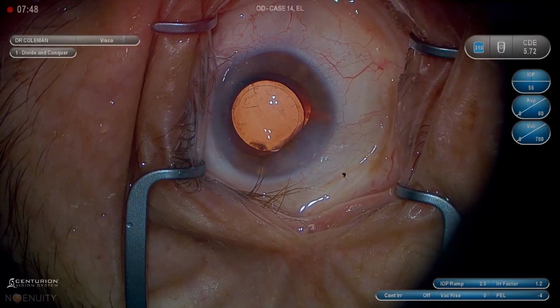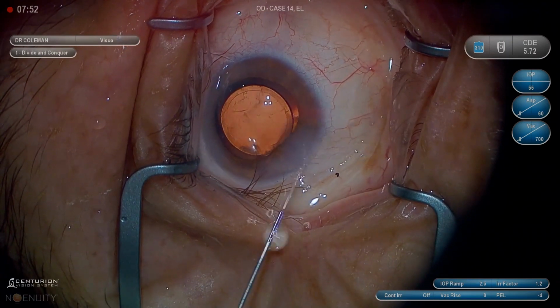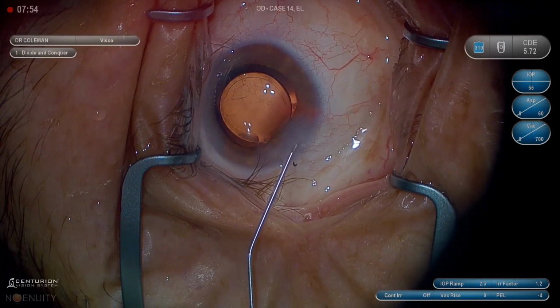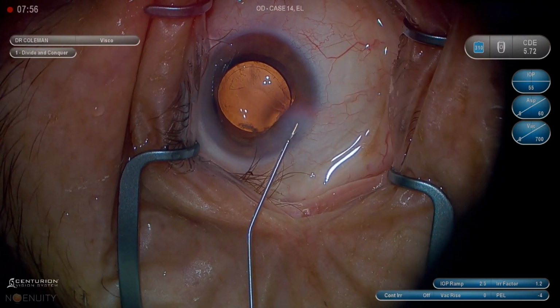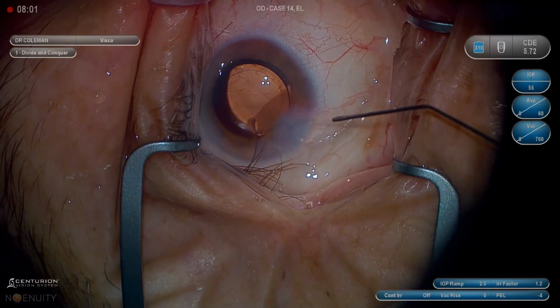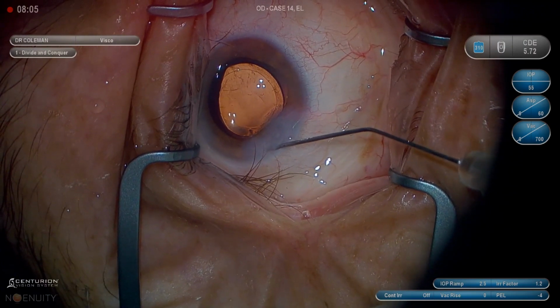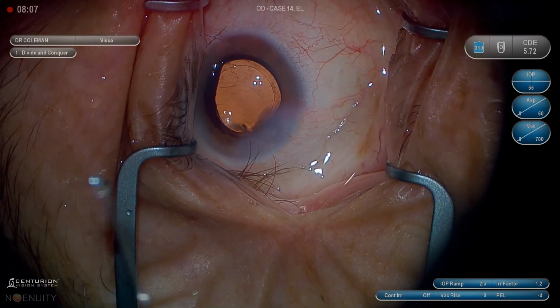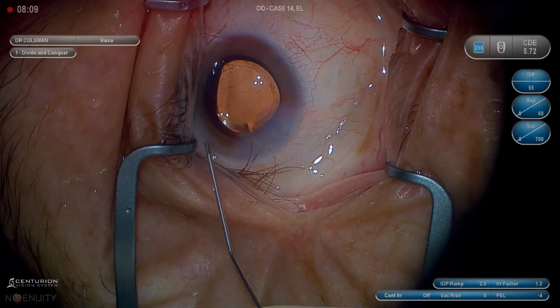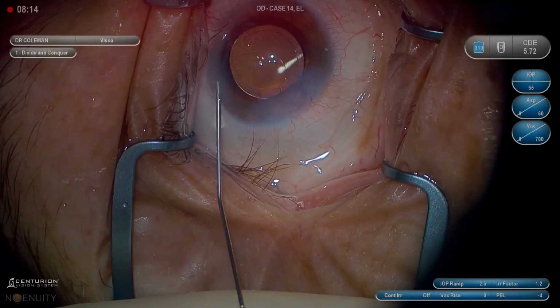And, you know, now maybe you've got to stitch through it. Now we've got a real problem on our hands. So I'm going to make sure that I meticulously hydrate without burping and without overpressurizing the eye, because I don't want to create flow back out that wound. So position 0 when you're doing IA, and at this point we want to minimize flow. We want to make sure that we don't overpressurize the eye like we did the first time, which led to the iris prolapse.